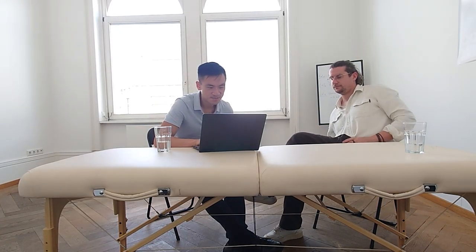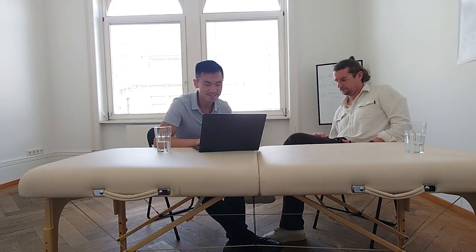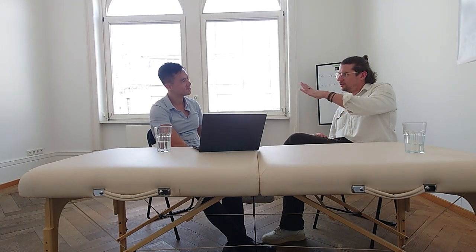I see. How do we control or standardize subject movements during testing? For example, ensuring proper arm raising technique without shoulder shrugging. Yeah, so therefore we have this mapping where each test has a specific video which is shown, and you have to copy that movement. But what we are not doing in the first row is correcting the patient. If the patient or the athlete is doing a wrong raising of the arm by, for example, shrugging, then it's a false pattern, but it is his pattern.